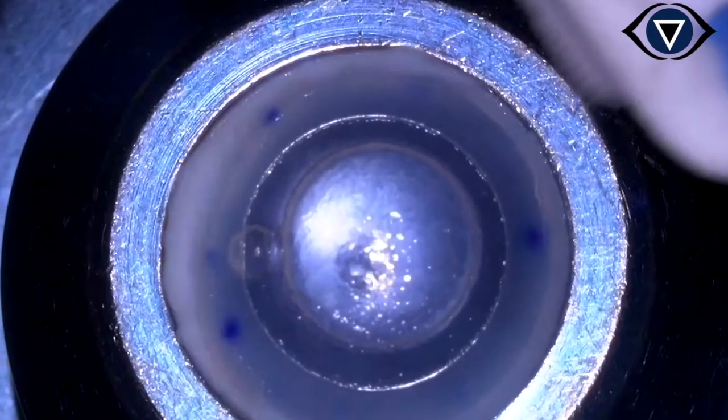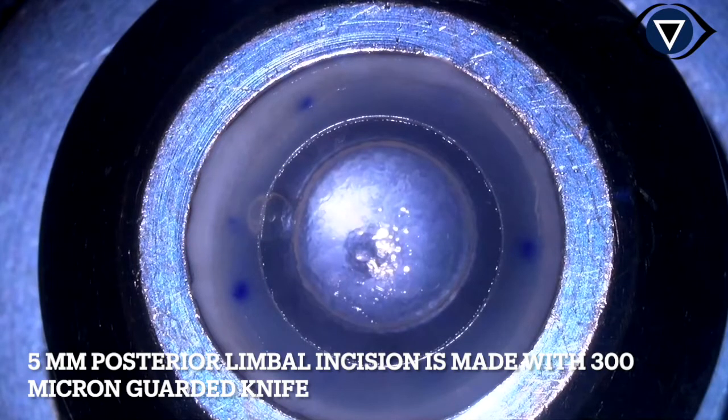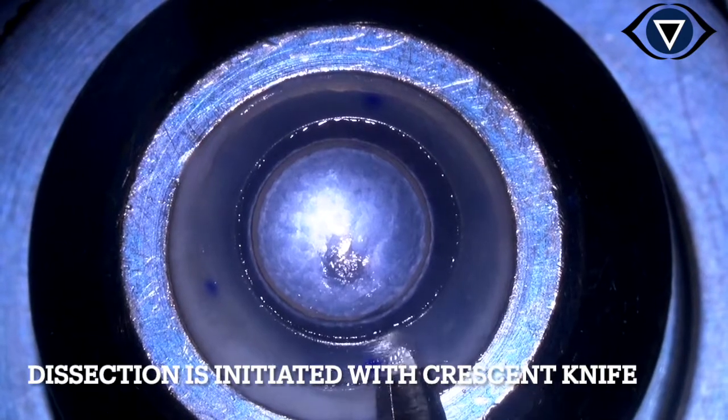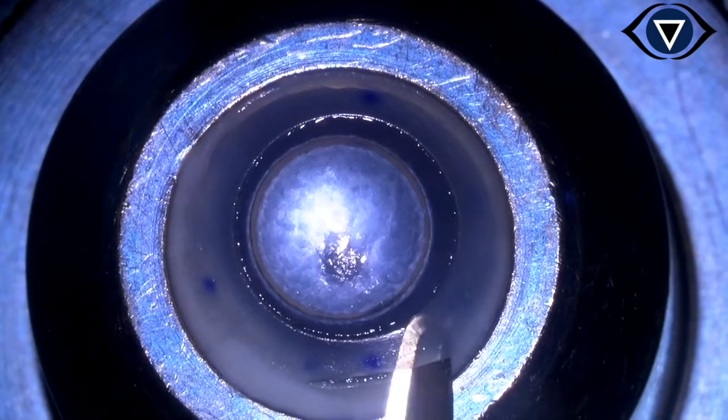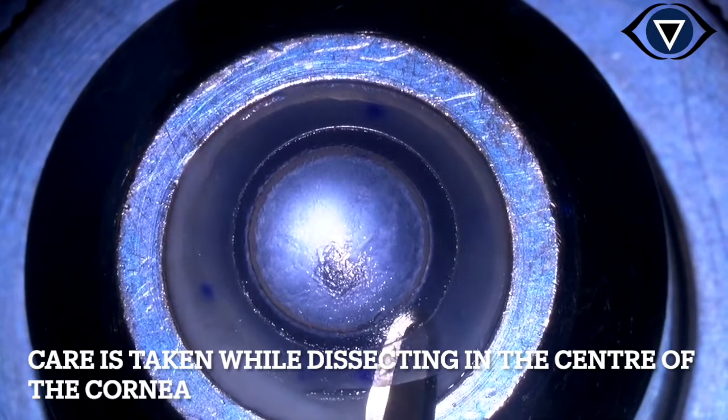But it's not over yet, because after harvesting this inlay, we realized that the donor cornea with a good endothelial cell count is still available with us. So we mounted it on a different artificial anterior chamber. After making an incision of 5 mm at the posterior limbus, the initial dissection was done with the crescent.